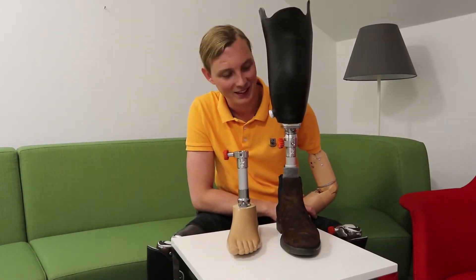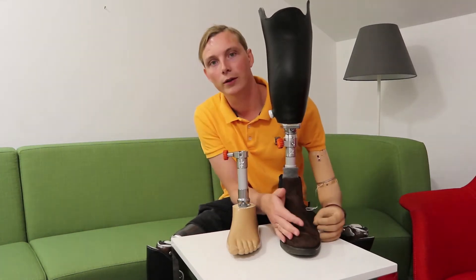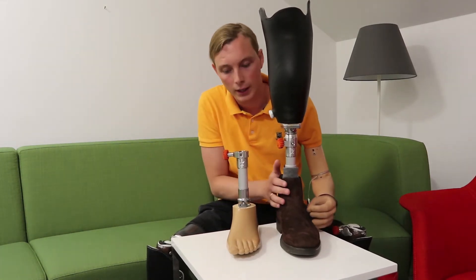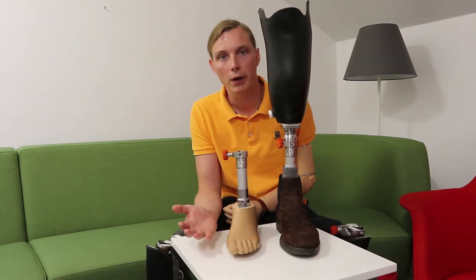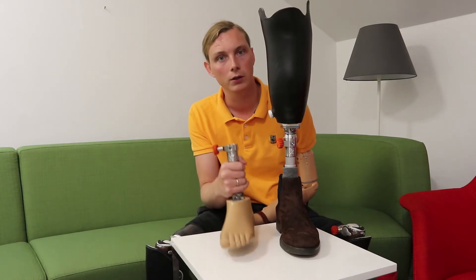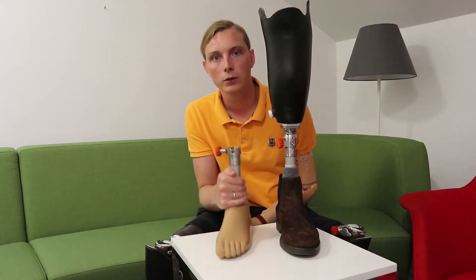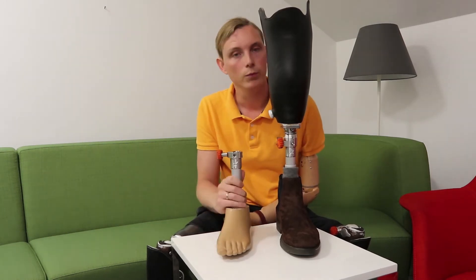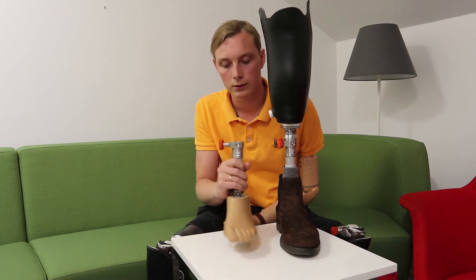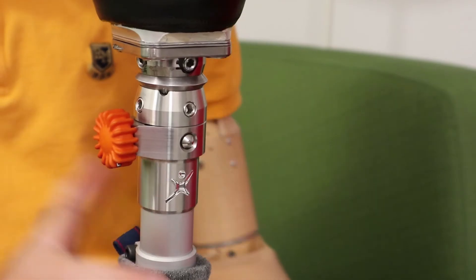The concept is, for example, here you can have your outdoor foot with a shoe on and then just quickly disconnect it and put on some other foot — for example, an indoor foot, or it could also be a running foot or a running leg, and it could also be a high heel if you want that. Really easy, and this is how it works.